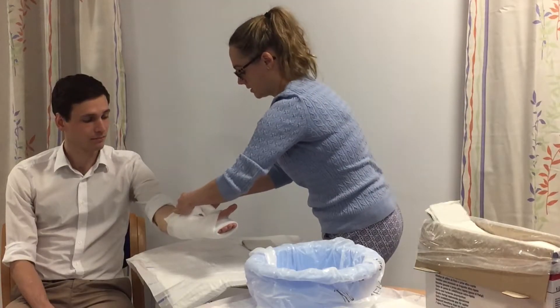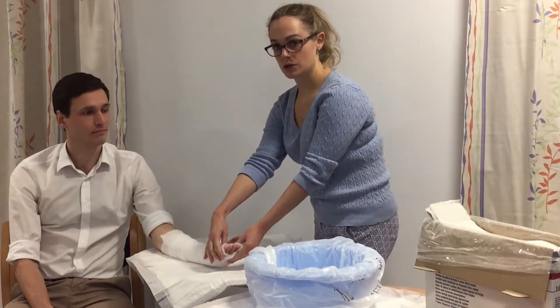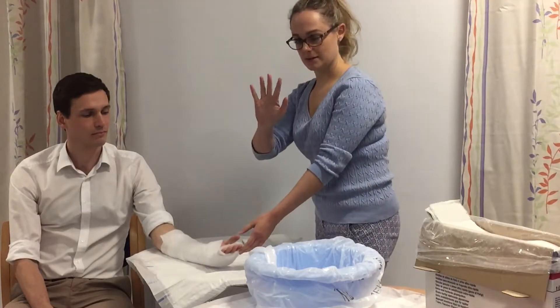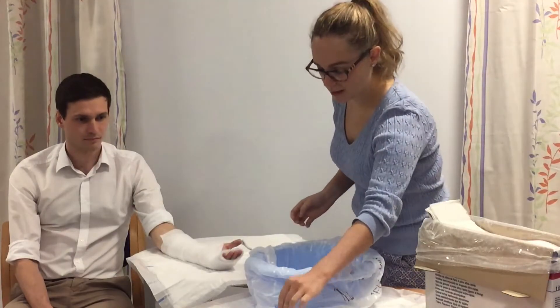You need to make sure that the fingers aren't too close together, so there needs to be a little bit of room so that the patient can move their fingers laterally. We don't want to wrap it too tight around the fingers.